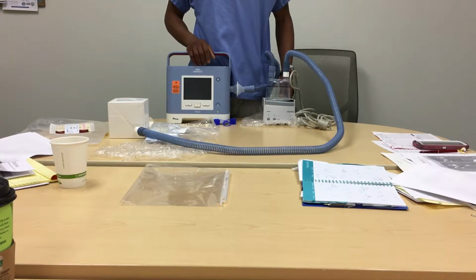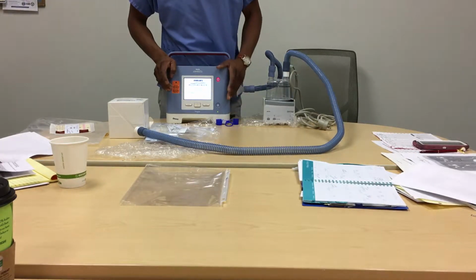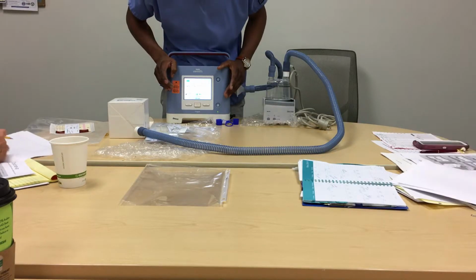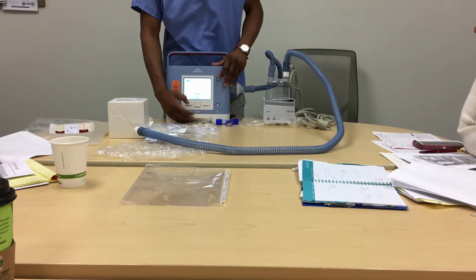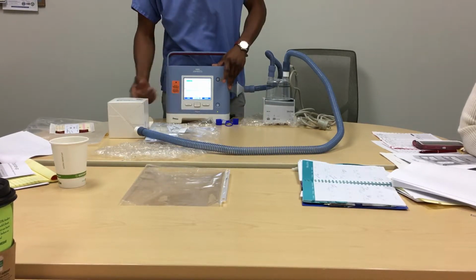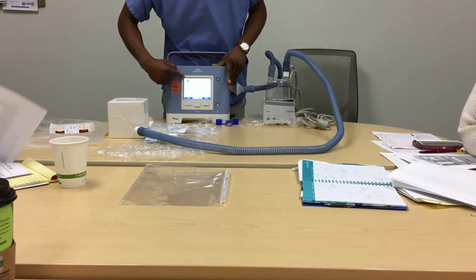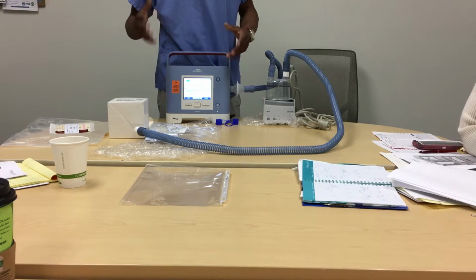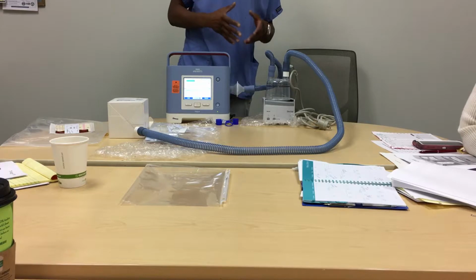Now, to turn it on, we push the power button. It comes on, and to get into the clinical mode, we hold the alarm silence button and the downward shift button. It lets you in. Up top here, you see the real time, in fact, what the patient is doing in real time.